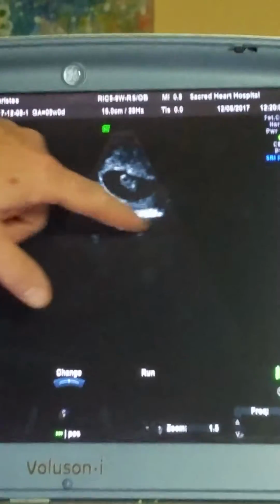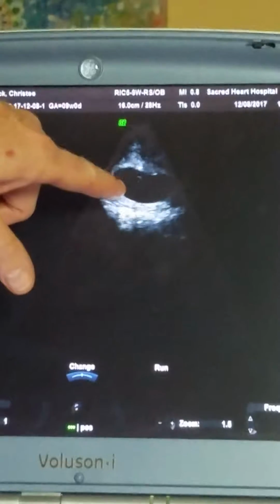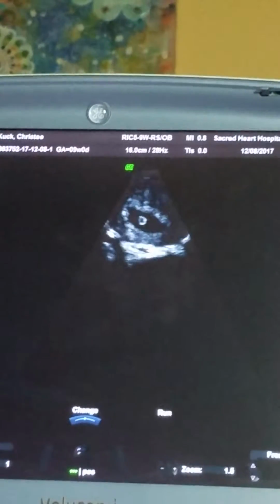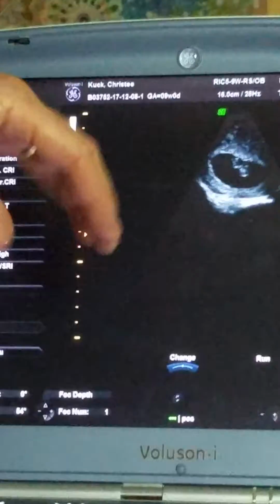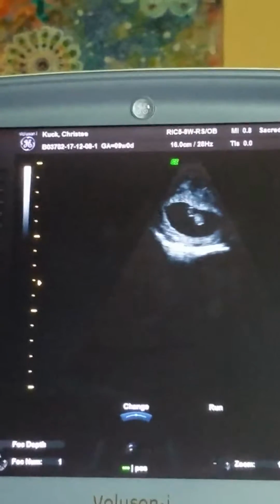Now you don't see anything that looks like placenta because you're just keeping everything warm, just like the old hens sitting on the egg, and they're getting all their energy out of the yolk sac. So, wow, you get to 16 weeks and you can't see the inside sac because it's fused with the outside sac, and then you can't see a yolk sac anymore. You can see where the placenta is.